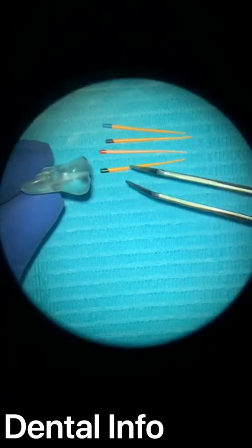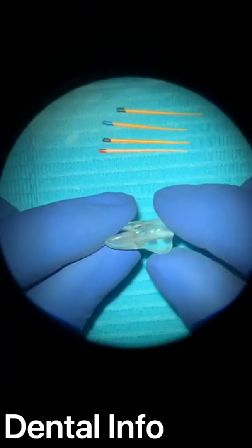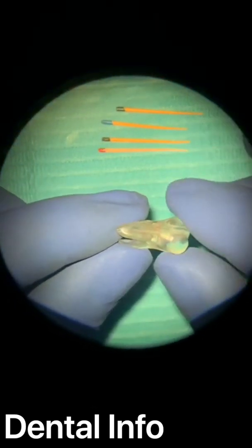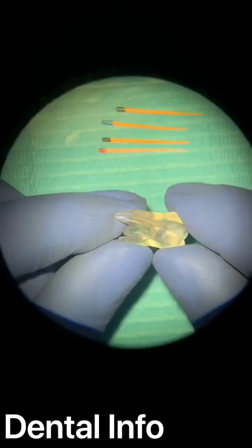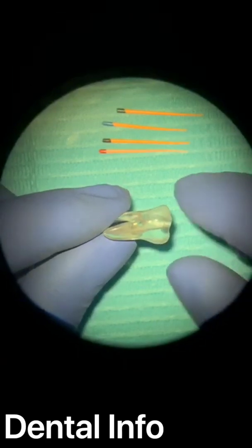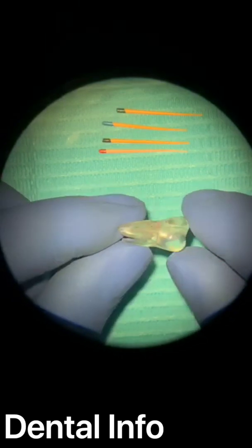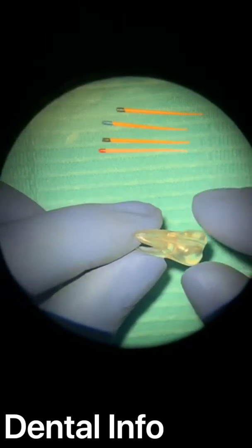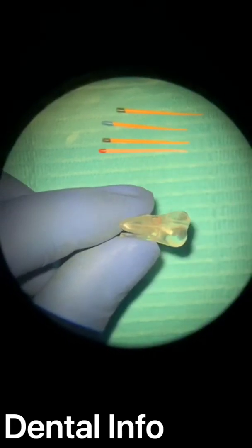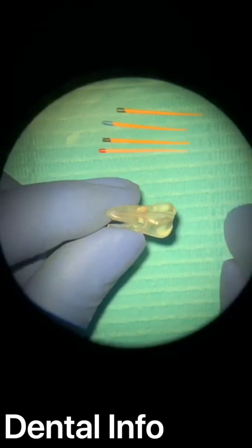So, today we will discuss this issue and how I can get 100%, nearly 100% real tugback and good obturation with our warm vertical compaction devices. So, tugback for a lot of people is not a problem. He says, oh, I don't have a problem with tugback because I am always gaining good tugback. But we have to differentiate real tugback from the false tugback.